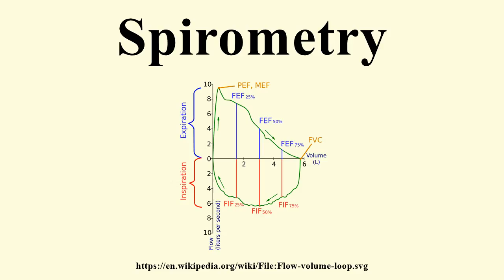Others. Forced expiratory time. Forced expiratory time measures the length of the expiration in seconds. Slow vital capacity. Slow vital capacity is the maximum volume of air that can be exhaled slowly after slow maximum inhalation. Maximal pressure. Pmax is the asymptotically maximal pressure that can be developed by the respiratory muscles at any lung volume, and PI is the maximum inspiratory pressure that can be developed at specific lung volumes. This measurement also requires pressure transducers in addition.